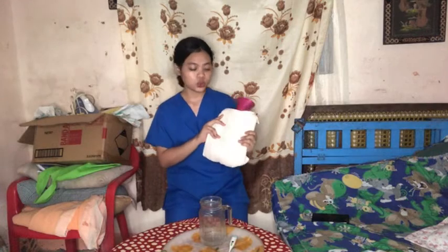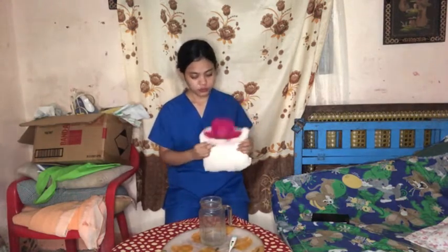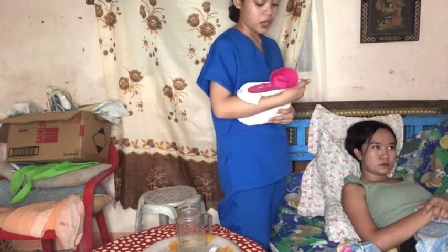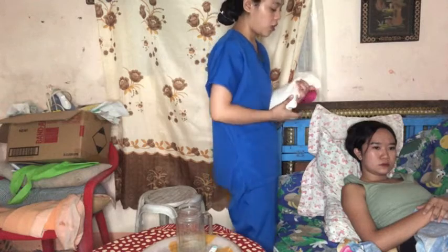So now we can apply or place the hot water bag to the patient. But before that, we need to tell the patient that we are going to place the hot water bag to the abdomen part of the patient. Okay, ma'am, I already prepared the hot water bag. So, ma'am, I'm going to place it to your abdomen part.